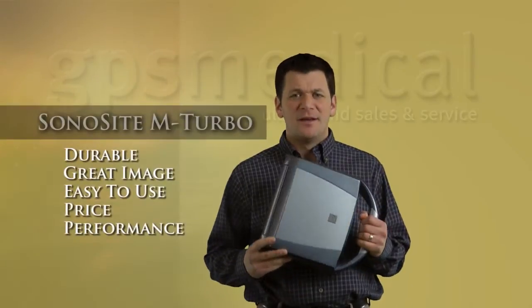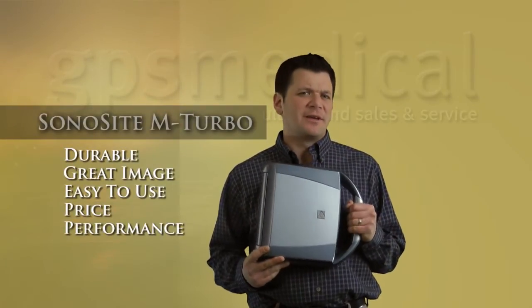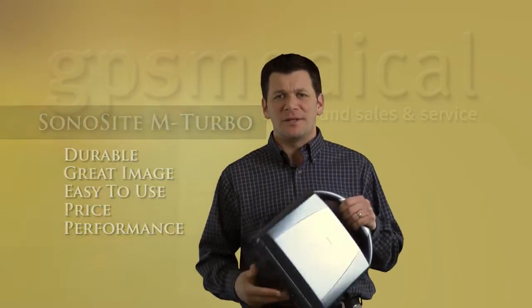I've always been a big fan of the Sonosite ultrasound systems because of their durability, good image quality, and relative ease of use. There's not a whole lot of thinking to do on these because they don't really let you do a whole lot to them. That's a bonus and also a negative, depending on what you want to do.